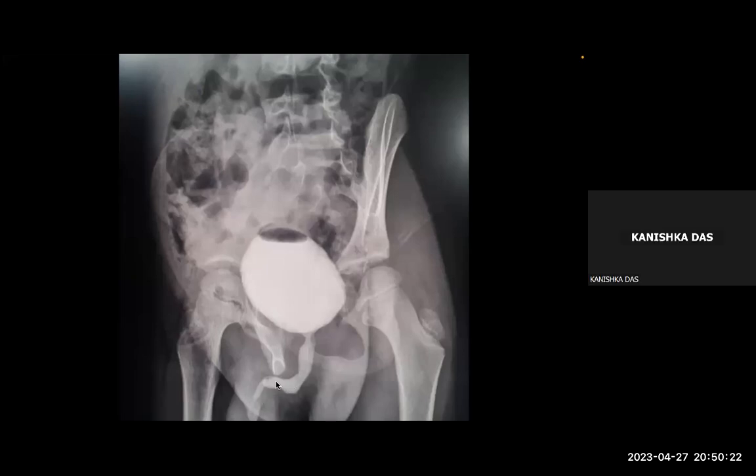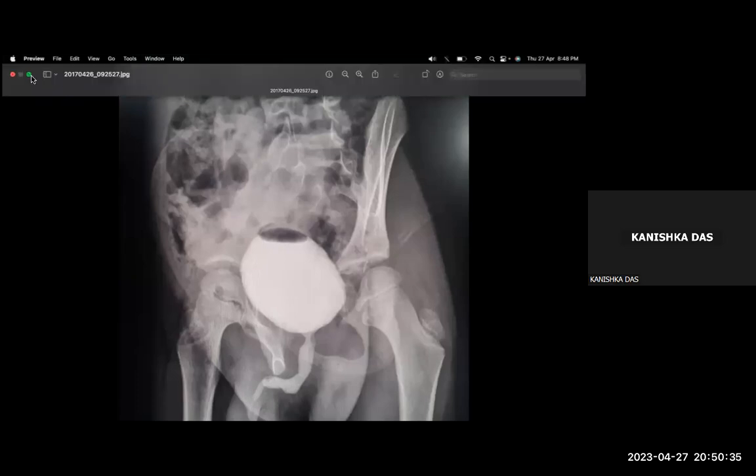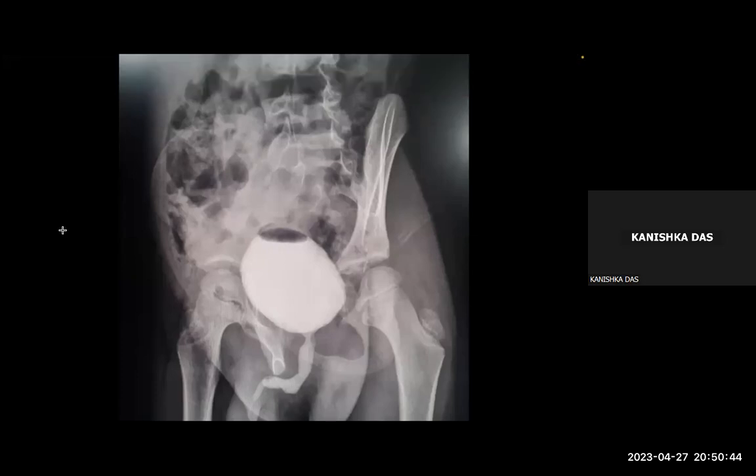So how would a valve appear, and how would you diagnose? Now, what would the next step be in diagnosis? So cystoscopy. Okay. Right. What else are you seeing in this child besides this? Are you seeing something else in the background? Bone. No, sir.